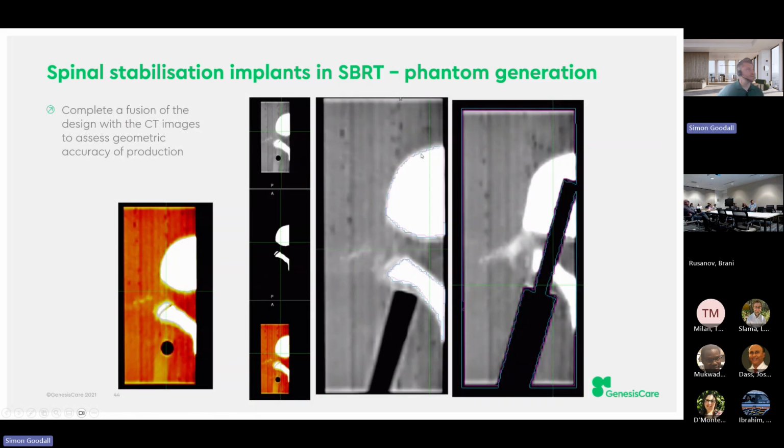We also were able to evaluate the geometry of the developed phantom by testing how well some auto contouring showed the comparison to the 3D print design. So we basically fused the scanned phantom with the design and contoured the bone, and we could see that the agreement was very high.